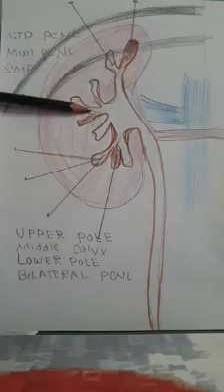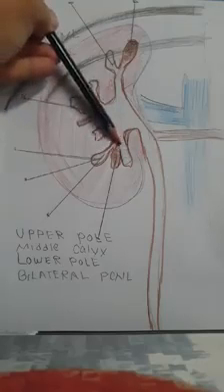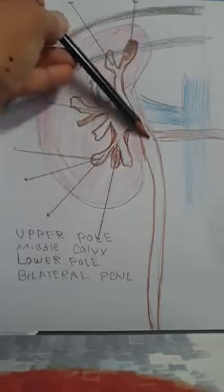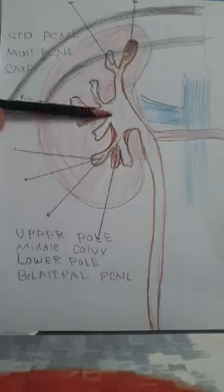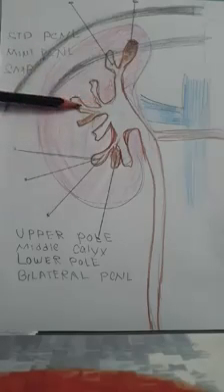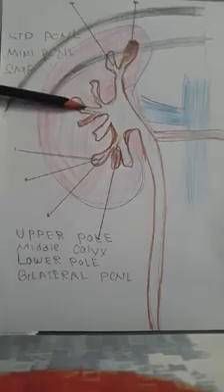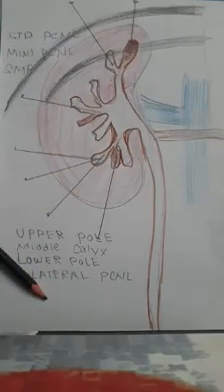Like here, sometimes when we approach from here, we can go all the way up to the inferior pole, and you can remove the stones. Also you can easily approach the pelvis and the proximal ureter, and sometimes you can even go up to the upper ureter. So for the middle pole, mini PCNL is a very effective way of doing PCNL also. Okay, so how do I do my bilateral PCNL?